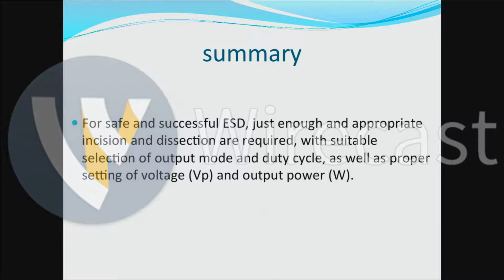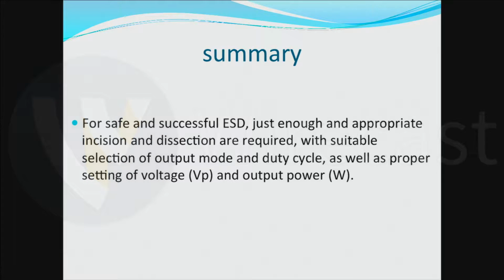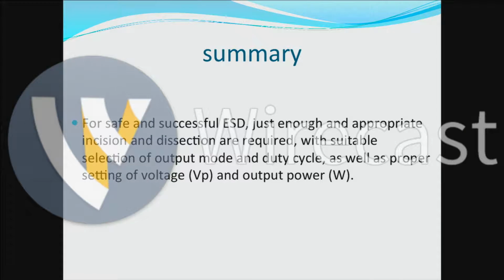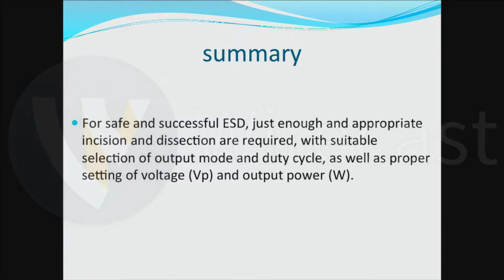In the previous slides, I saw the picture showing that if we use a bipolar or unipolar mode electric current setting, the electric pad, for example when we do ESD at the stomach, we put over the stomach. Is there any difference if we put the electric pad over the stomach or over the leg?